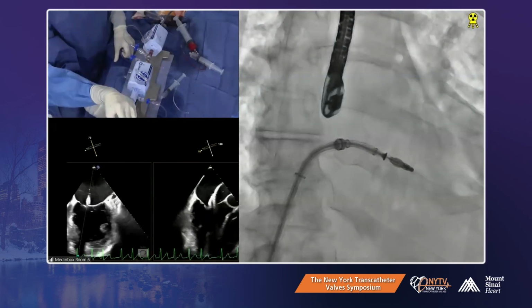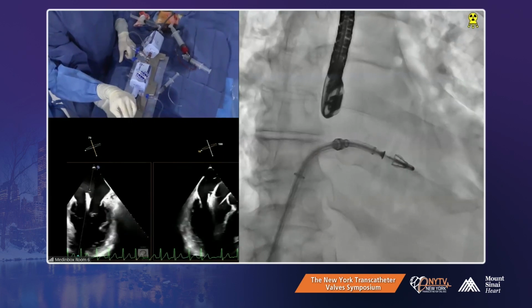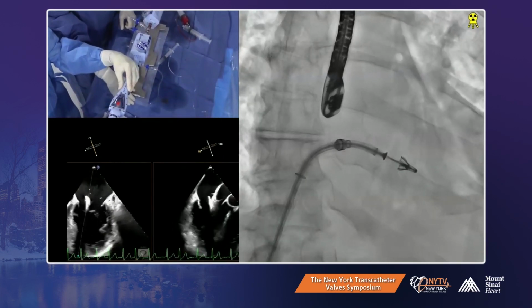So we're going to raise the grippers now. We're going to unlock the clip, open the clip, and we're going to check our arm and gripper orientation. Because you want to start a little medial.